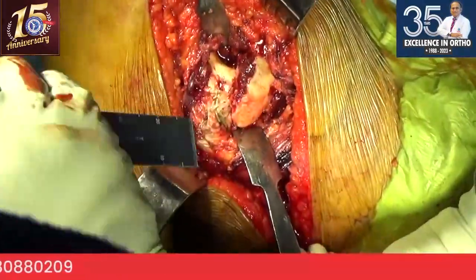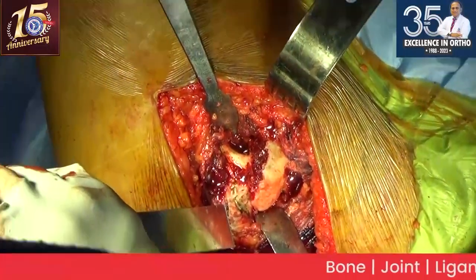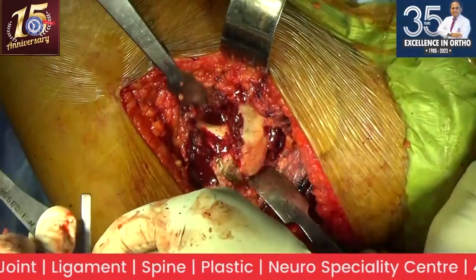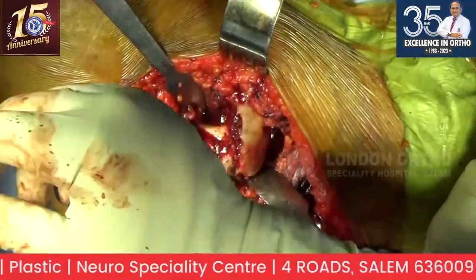For the benefit of the younger surgeons, could you show the trial and where the head is off? If you can have a template for the stem. So we are able to see the GT. Give the trial with the metal.